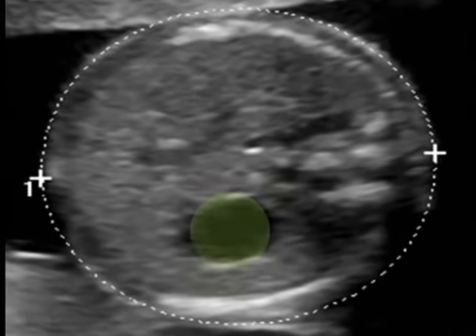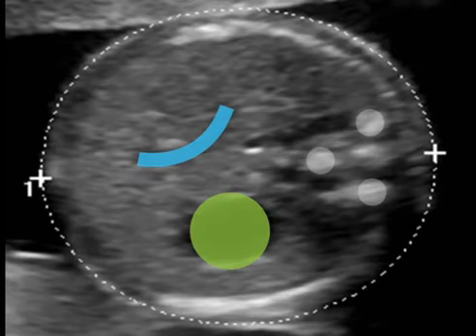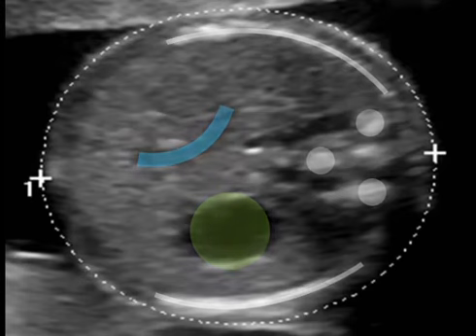In addition to the fetal stomach and umbilical vein, several other anatomic structures are visible in this view. 3 ossification centers represent the vertebral body anteriorly and the junction of the vertebral laminae and pedicles posteriorly. Ideally, only one rib is visible on each side of the abdomen, indicating that the image was not taken at an oblique angle.